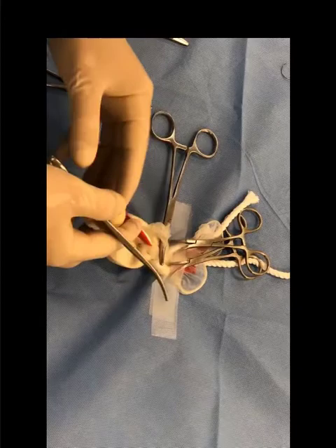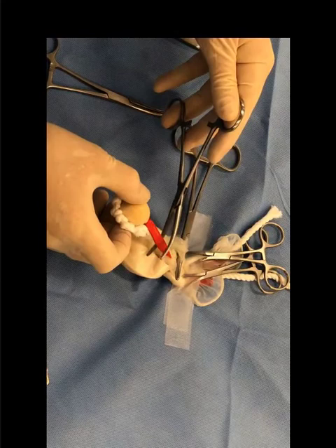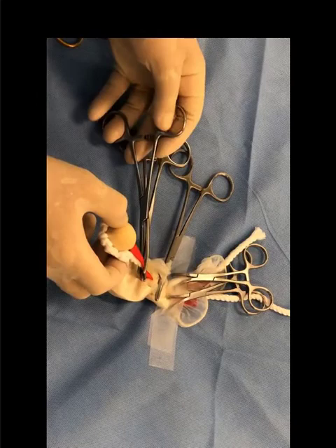Now we're going to place our clamps across the vascular pedicle. We're going to use Rochester Carmalt clamps — you can see they have longitudinal grooves in them, which allows the suture to sit into the groove. We're going to do a modified two-clamp technique. We go across perpendicular, just having the tips through, always with the tips pointing upwards — that's one — and then place another one distal to that, so we have two clamps in position.